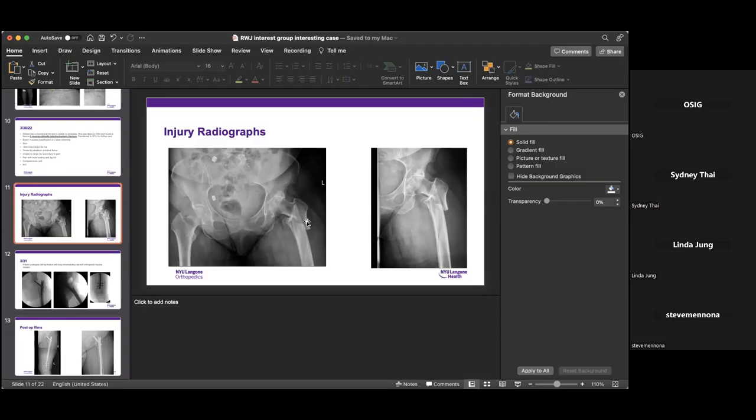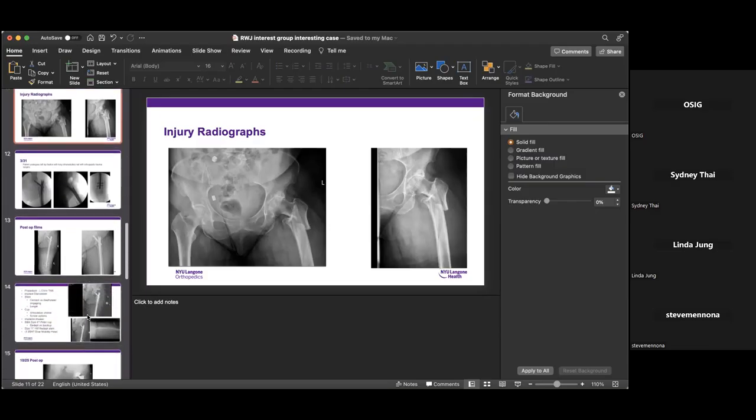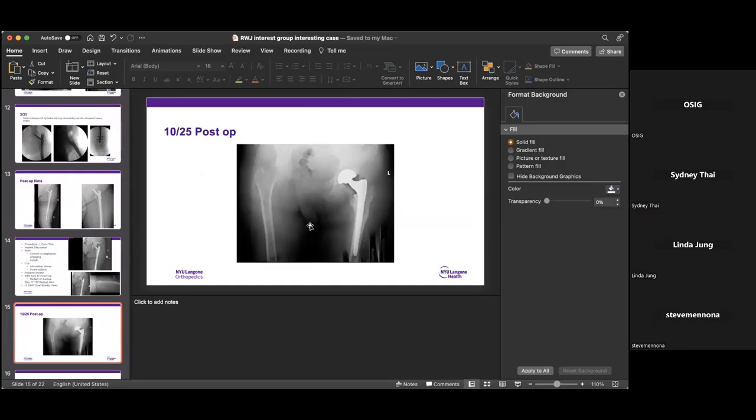So I would put this implant in right over here, right? But you can see over here that even though it's not perfect, it's healed. And the muscles that attach from here to here, your abductors, need to function in order for you to have a stable hip. So it's kind of an upper level question. But it would be doing the wrong treatment for the wrong fracture, if that makes any sense. I see. Thank you.